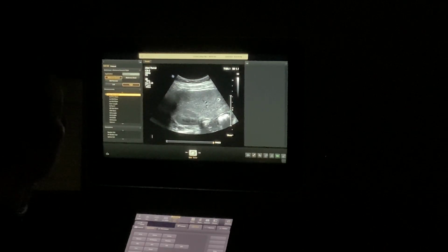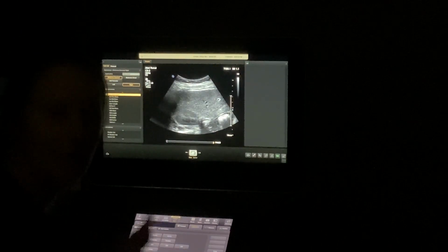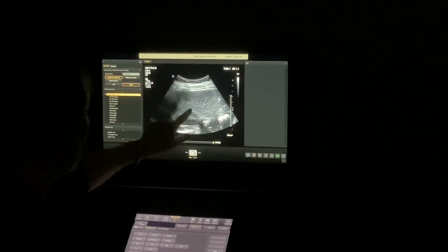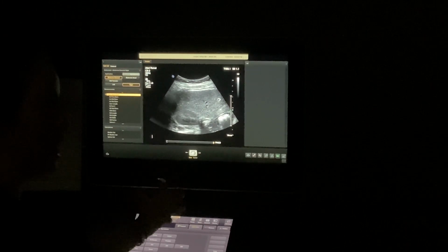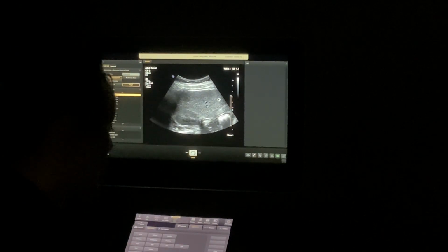I will warn you, be careful when you're doing the superior kidney in relation to the liver. It can look like a liver mass, okay? Instead of the superior kidney. It can look like it's in the liver instead of outside of it. Do you see here where I made sure to see that margin? Where I could tell that it's sitting outside of it. Sometimes when you guys were taking your liver pictures, unintentionally you were capturing the kidney and it was looking like a mass within the liver. Okay, so just be aware of that when you're doing it.